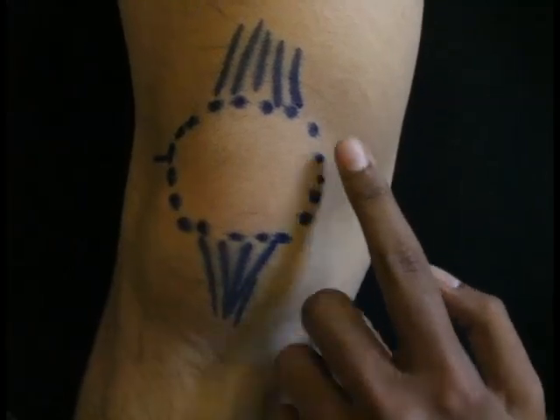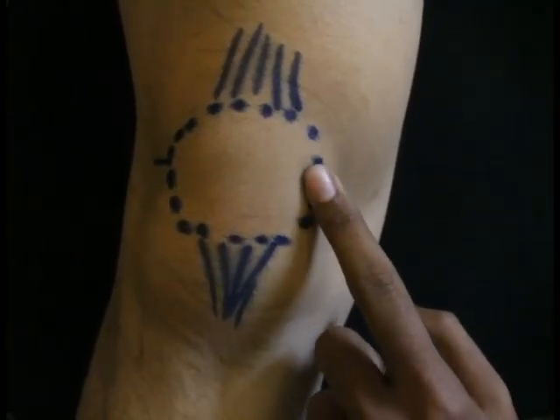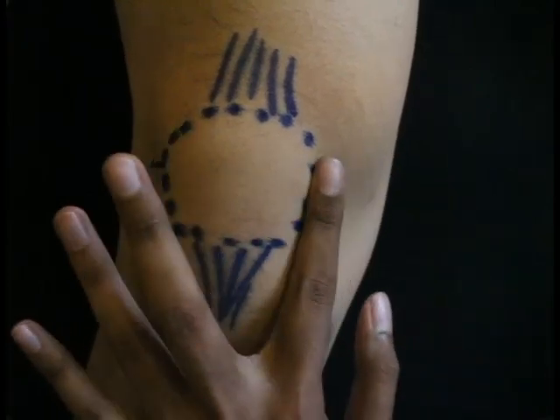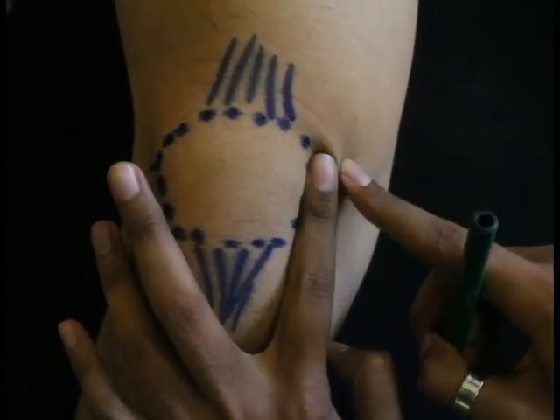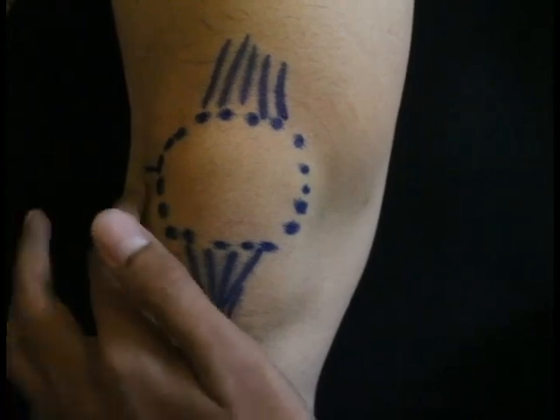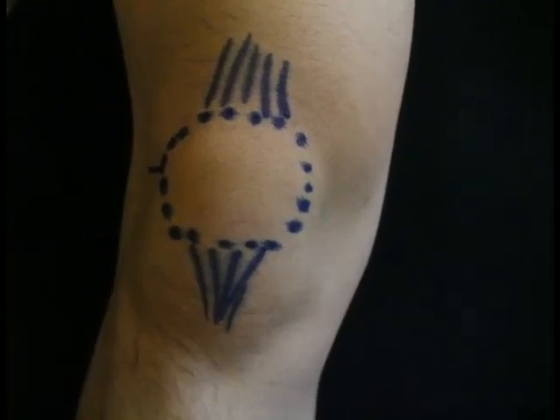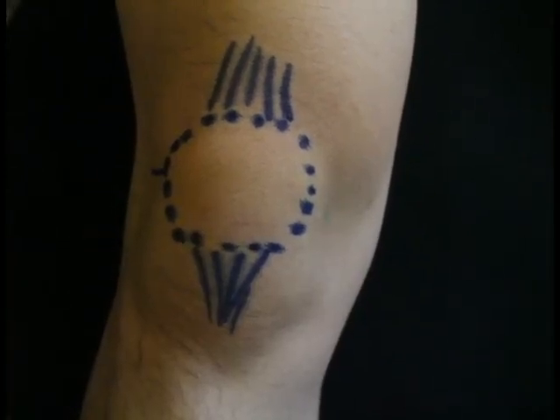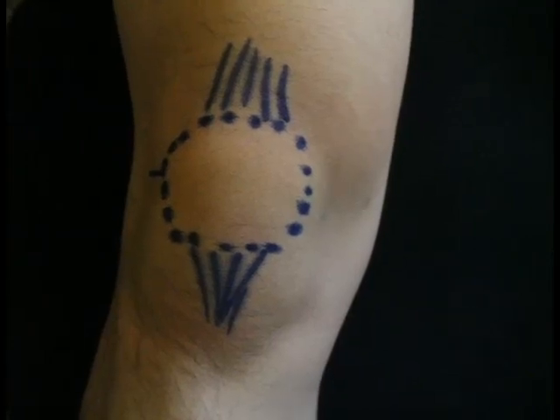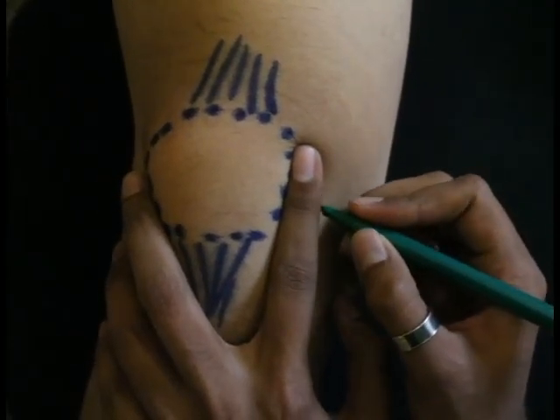Identify the mid-medial border of the patella. The medial patellofemoral cleft can be located one finger breadth away from the medial border of the patella. The lateral patellofemoral cleft is narrower and the joint capsule is tougher, thus the medial cleft is preferred. Mark the medial patellofemoral cleft — this is where the needle will be inserted.